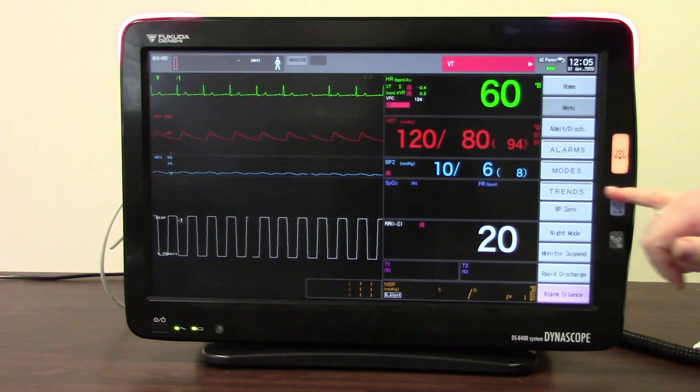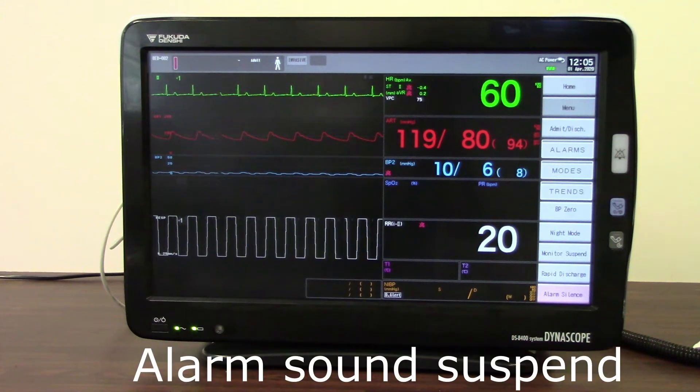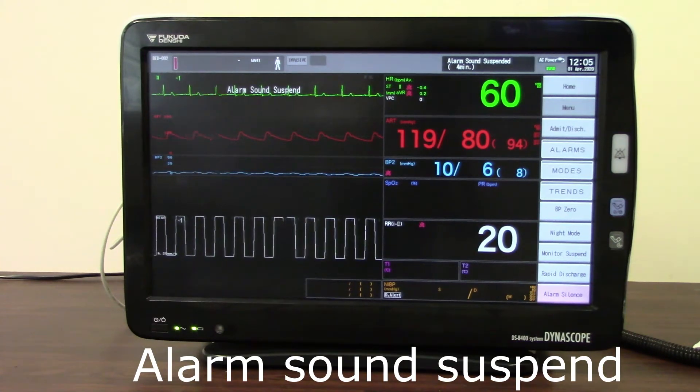The other thing I can do with the alarm silence button is press and hold it. If I press and hold for three seconds, I will be able to activate the full alarm sound suspend. What that does is suspend all of the alarms across the board so that nothing during that time will alarm. You'll hear three beeps, and you will see a countdown clock at the top of the monitor that will count down depending on how your alarm sound suspend has been set up. Once it reaches zero, everything will go back to fully alarming.